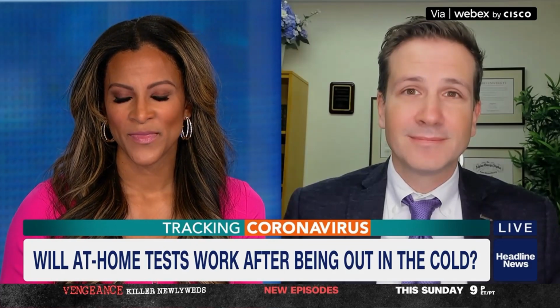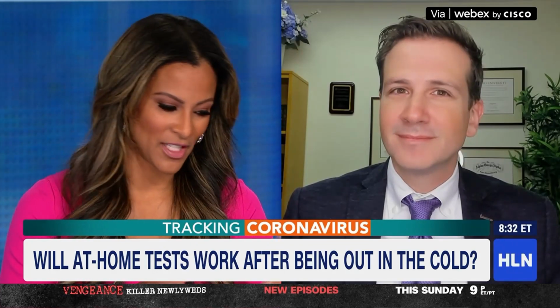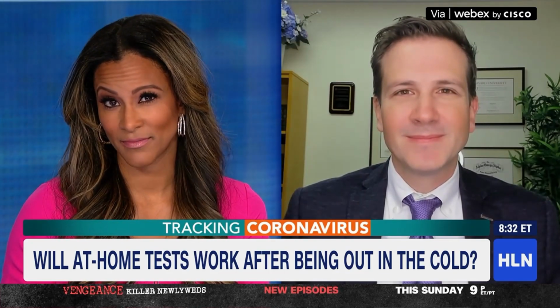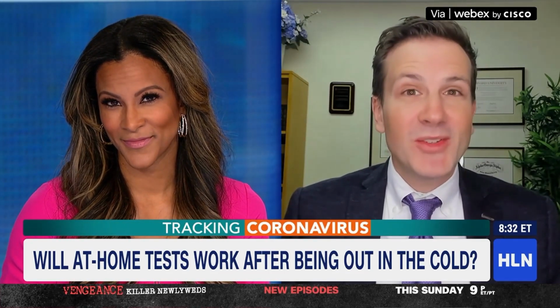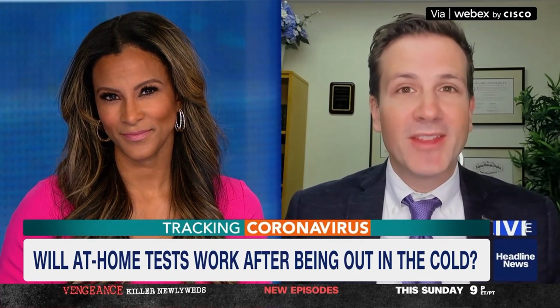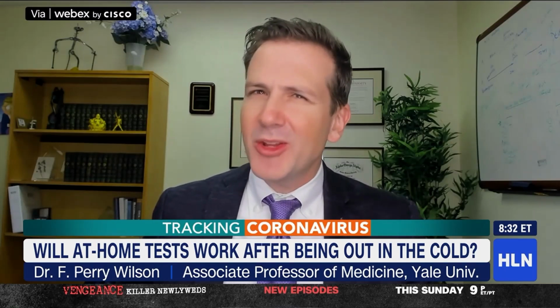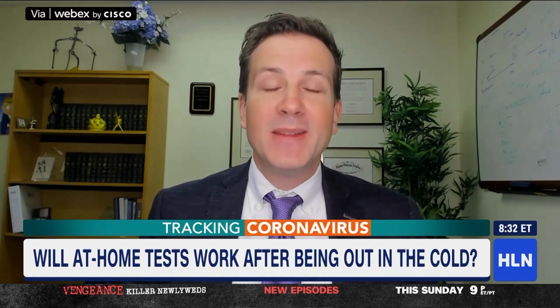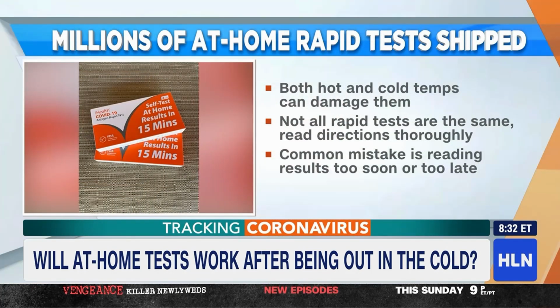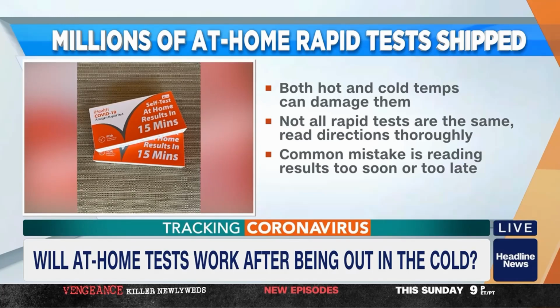When you get them, where do you store them? Because if you leave them in the car or they're outside, would they not be as accurate maybe? Yeah, there's some concern certainly that if they get frozen, it might affect the performance of the tests. Now, the FDA has released guidance on this. They say it's okay, actually, if they get frozen for a couple of hours, even up to a day. But you really want to check your mailbox, bring them inside, and most importantly, when you use them, make sure they're at room temperature. So let them come up to room temperature before you go ahead and use those tests.